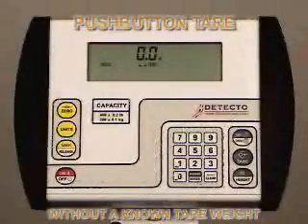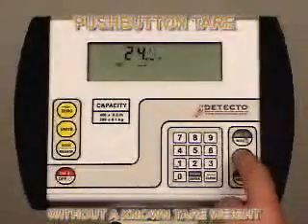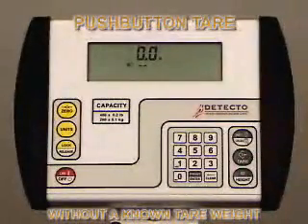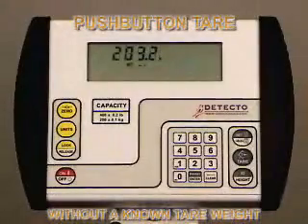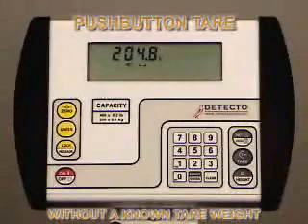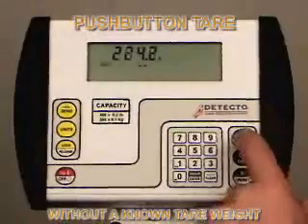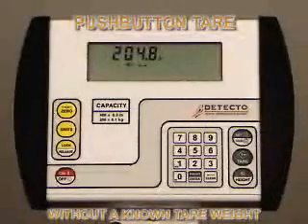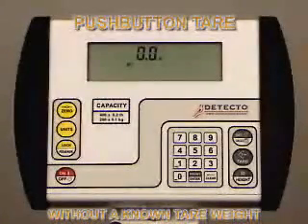Push-button tare operation without a known tare weight is a simple two-button process. The object being tared is placed on the scale, whether it's a walker, wheelchair, or whatever is being tared. Press the tare key twice — the indicator will display zero net. Then remove the wheelchair or walker and return to the scale with the patient to be weighed. The patient and the tare weight can now be weighed on the scale and the net weight is displayed on the indicator. This is the weight of the patient only. You can press the gross key to show the gross weight and press it again to toggle back and forth between gross and net weight. When the patient and object are removed from the scale, the display returns to zero. Press the gross key again and it will show the tare weight.